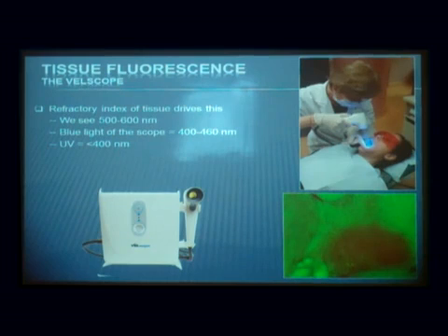And it's based on the fact that we all glow. I know the advertisers talk about that glow after you take a shower or use a certain product, but you actually do glow. There are certain molecules in all of us that are available to glow. They glow every time they're hit by a certain amount of light at different wavelengths. And bacteria have different kinds of light, and they glow at a different color and different rate. We glow at such a low level that we can't see that glow unless we use special goggles and really turn all the lights off.